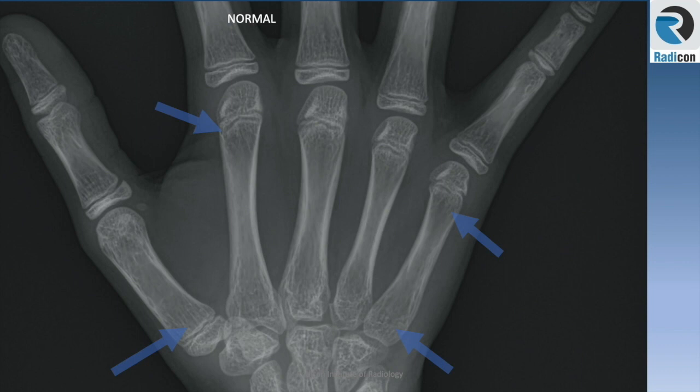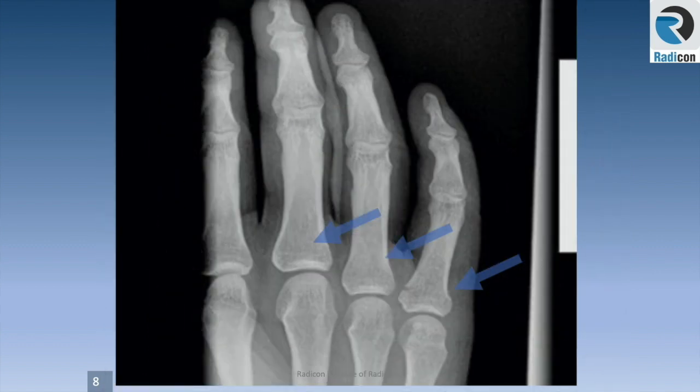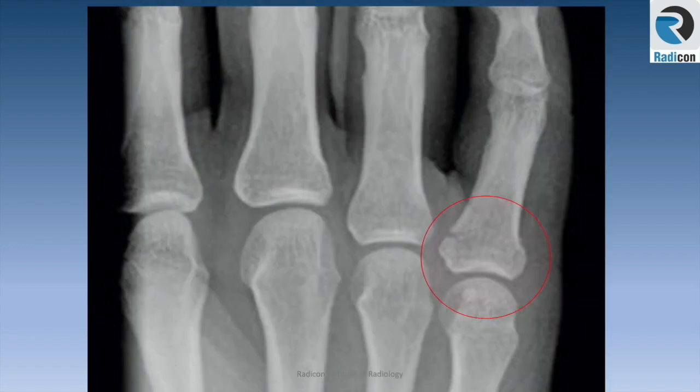This film on review looks normal. Let's look at case 2. The first thing is to zoom it up. Zooming makes it easy to see a fracture at the base of the proximal phalanx of the little finger. It is worth paying attention to how you write this abnormality.